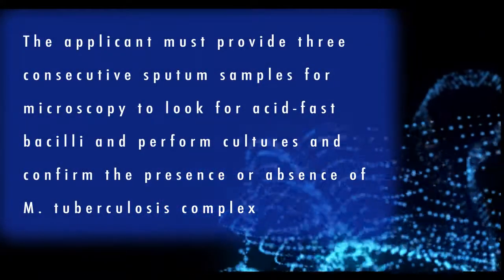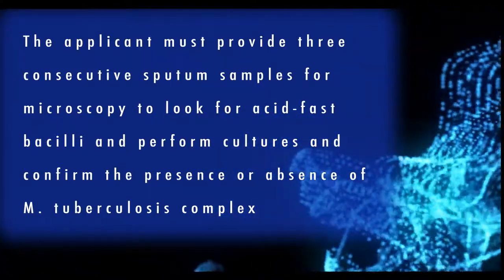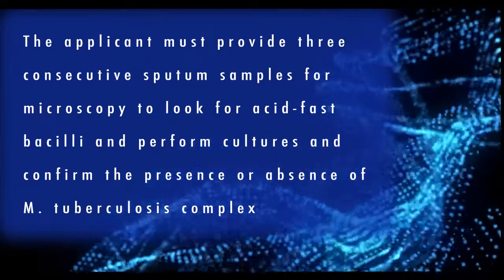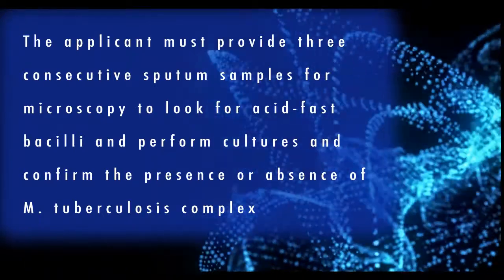the applicant must provide 3 consecutive sputum samples for microscopy to look for acid-fast bacilli and perform cultures and confirm the presence or absence of M. tuberculosis complex.